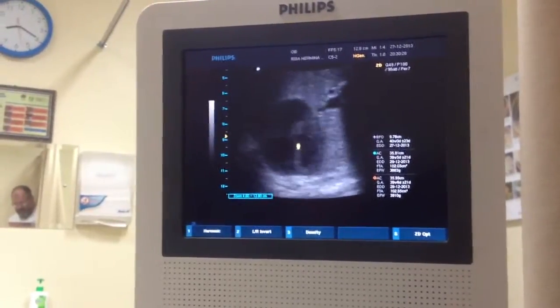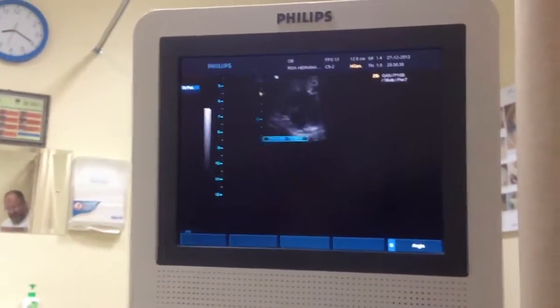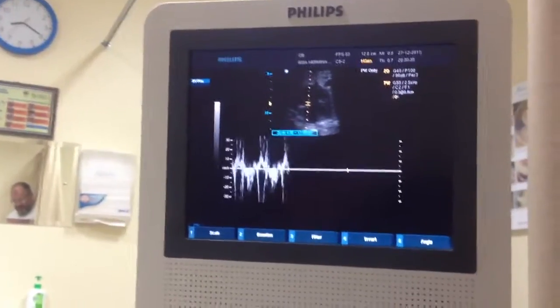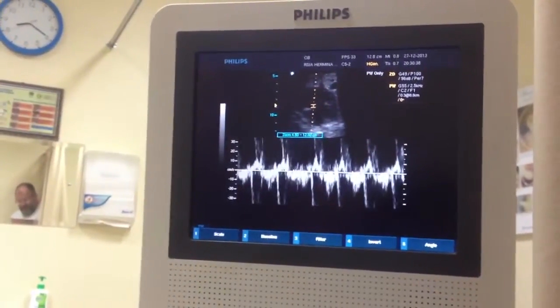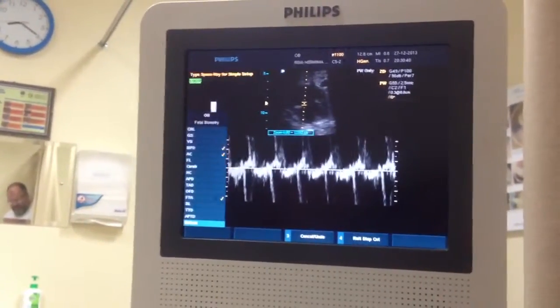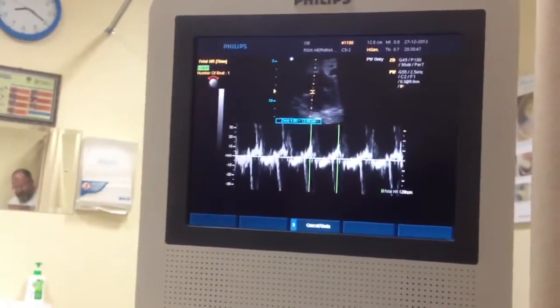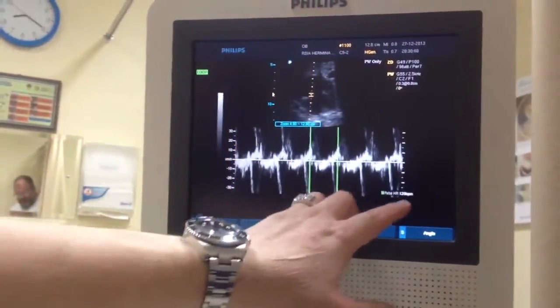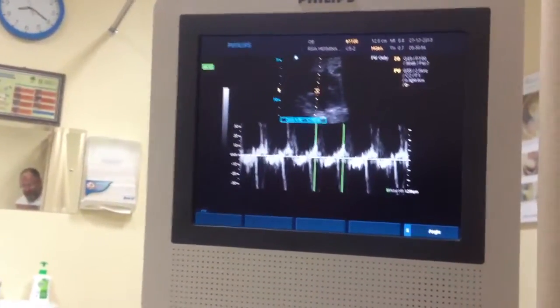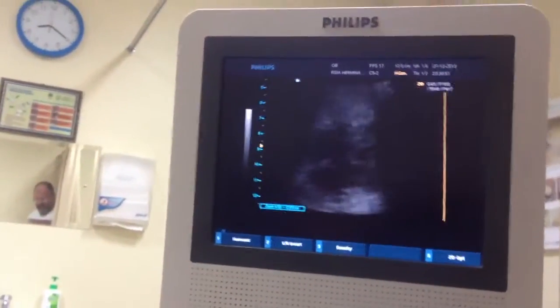There's no bocor. Before I had fever, the heart rate was faster. It's okay this time? Yeah, sure. This is the right ventricle. The rate is — this is the peak, and this is the peak — 129. So it's normal. Because the normal range is 120 up to 160. Yeah, the degree is within normal range.